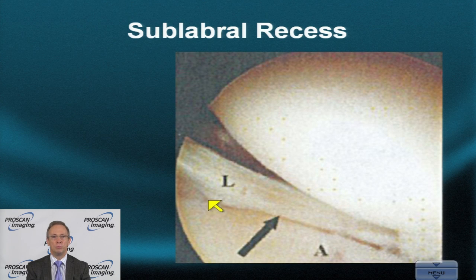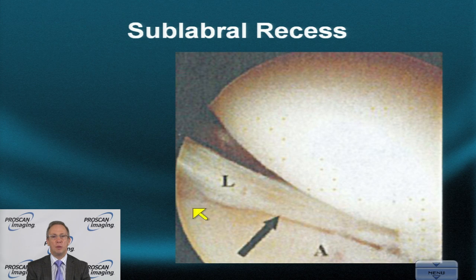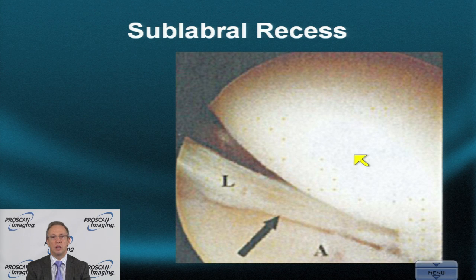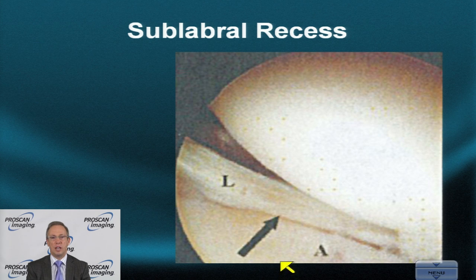Here is the sublabral recess, which deepens as one moves towards the eight o'clock position. The acetabulum is visible, and just below the mid-acetabulum or nine o'clock position, the labral sulcus becomes apparent. The femoral head is to the viewer's right, with anterior acetabulum, posterior acetabulum off-screen, superior to the left, and inferior to the right.